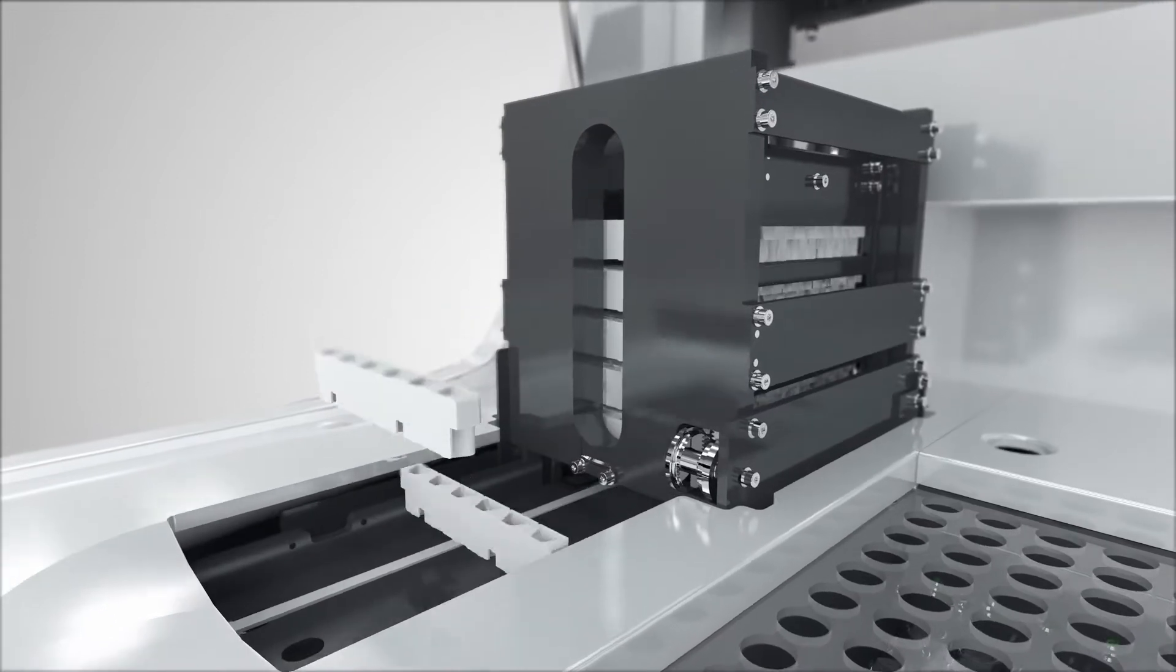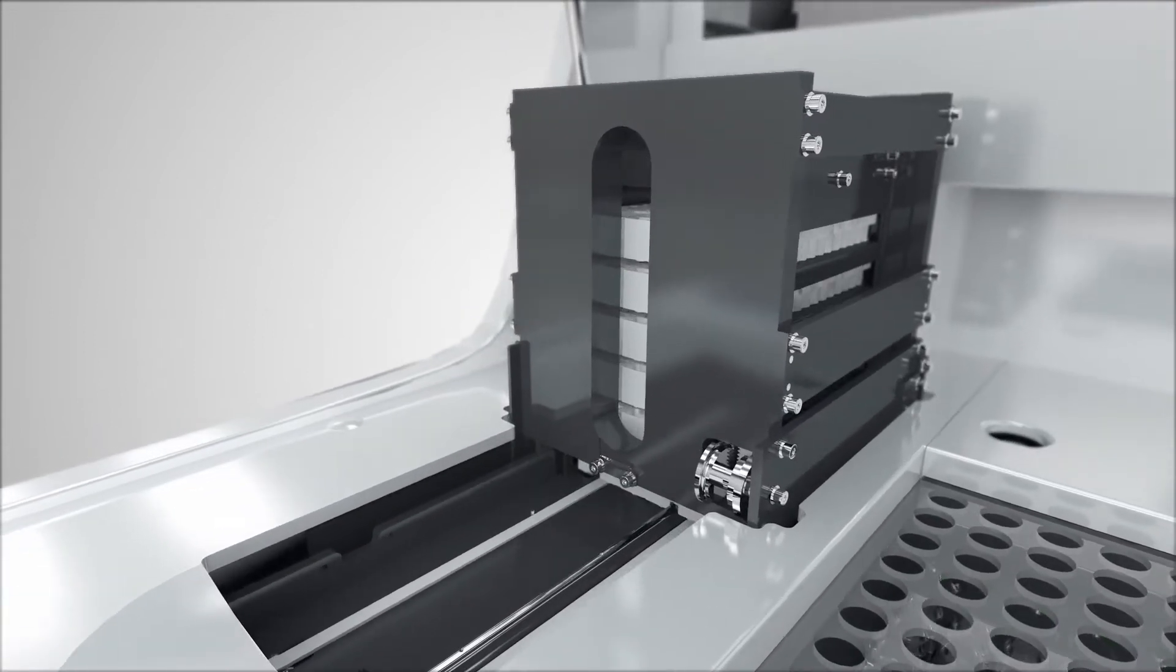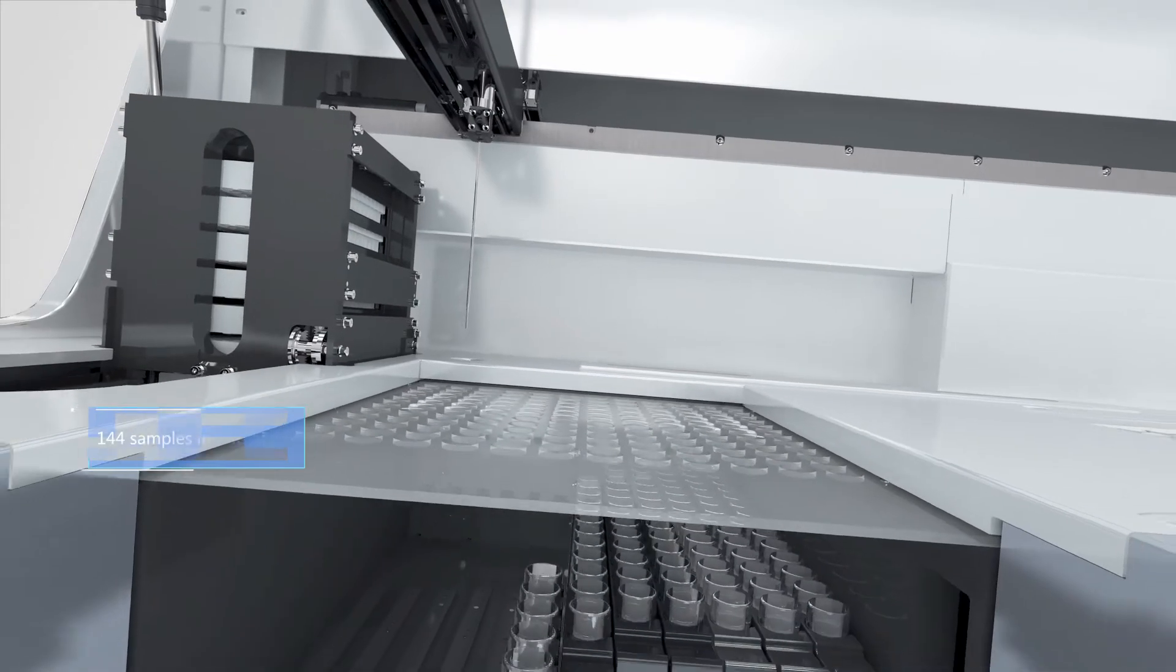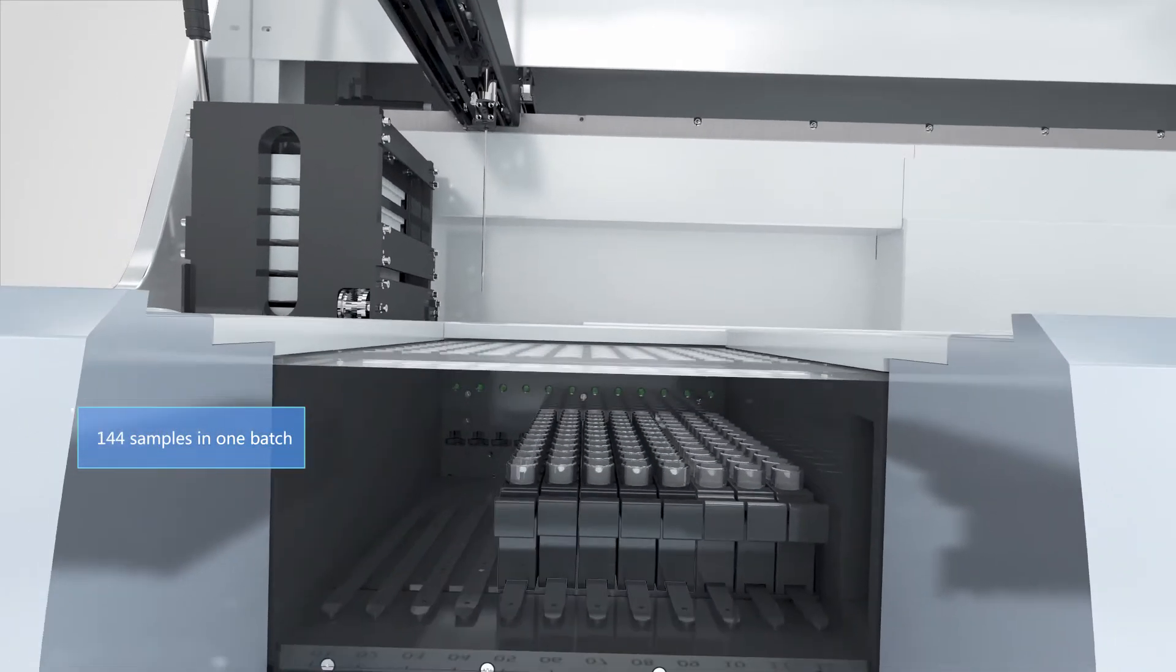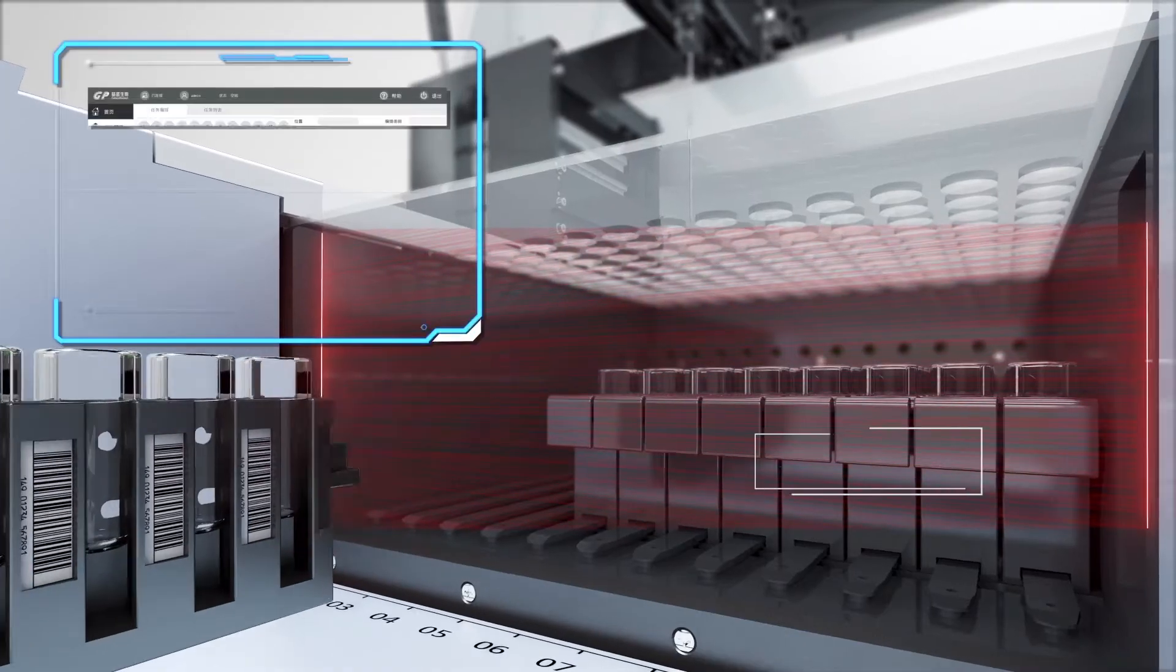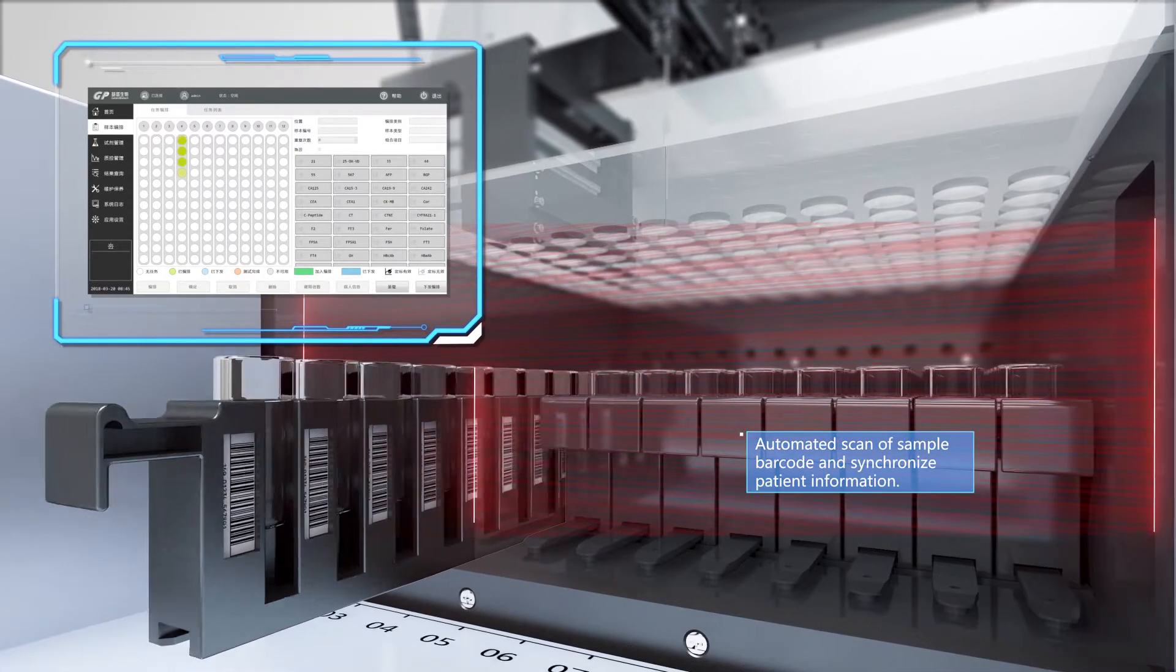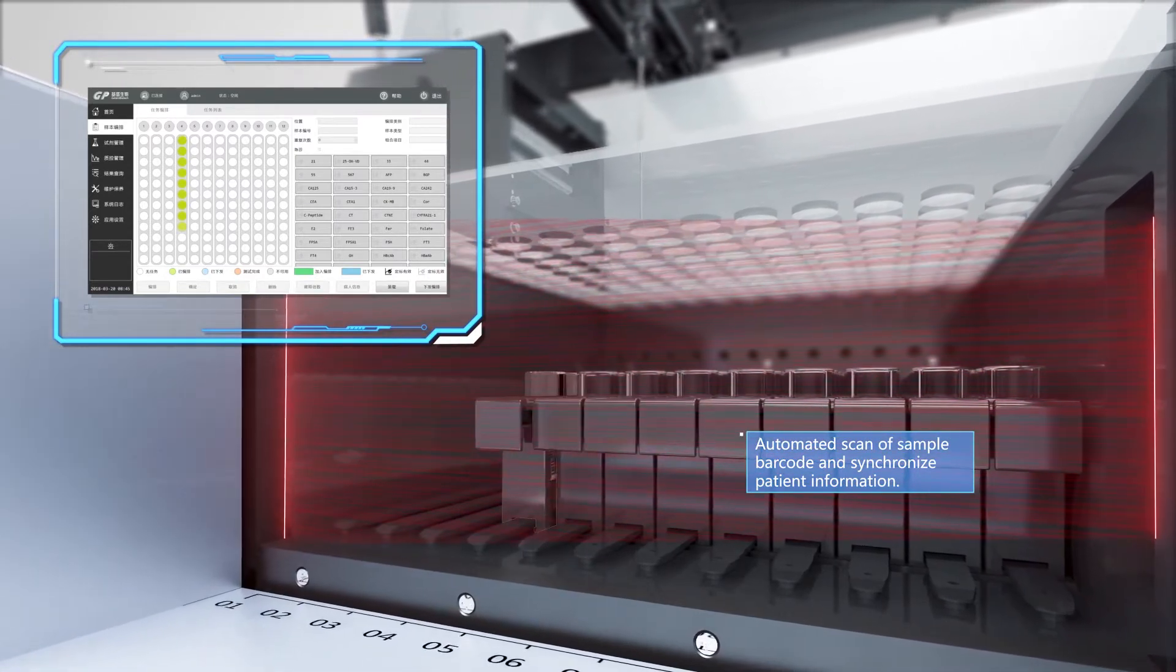Automated sample loading system with a sample volume of 144 samples in one batch. Automated scan of sample barcode and synchronized patient information.